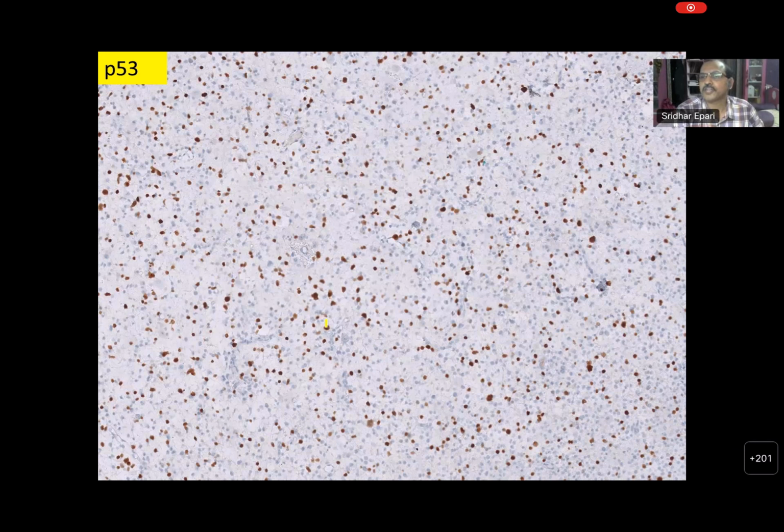So between the astrocytic group tumors and oligodendroglial tumors, P53 mutation is commonly seen in astrocytic tumors. Yes. When you get an overexpression, it adds to the information you got from ATRX. It reconfirms your approach that this is an astrocytic tumor. You thought it was an astrocytic tumor, and you demonstrated P53 also. It's closer to supporting that. You know that this is an astrocytic tumor, IDH mutant.